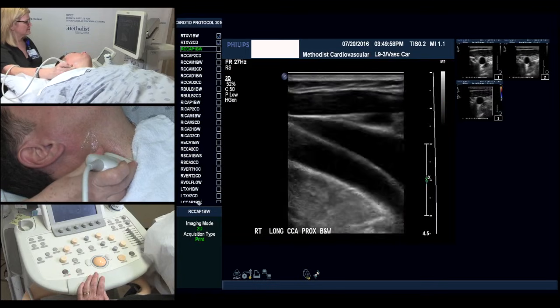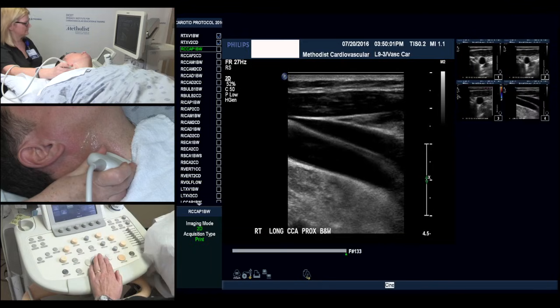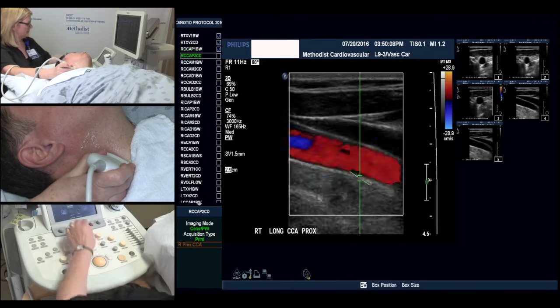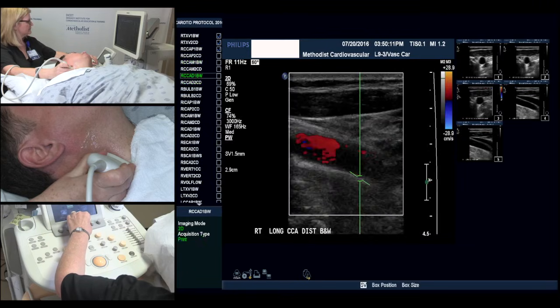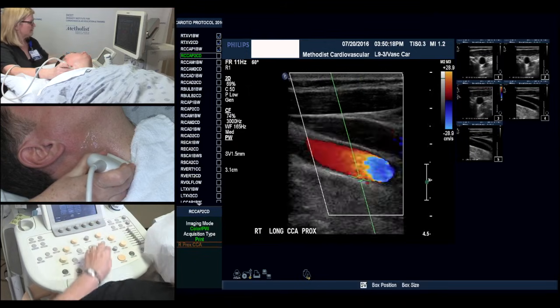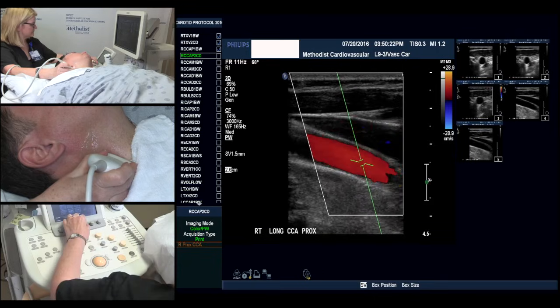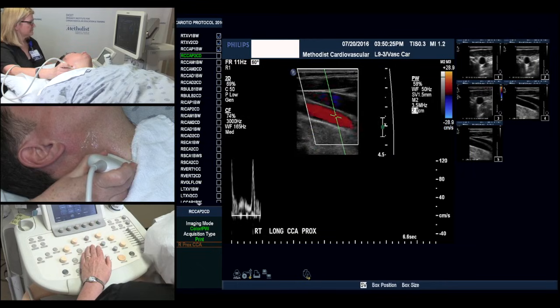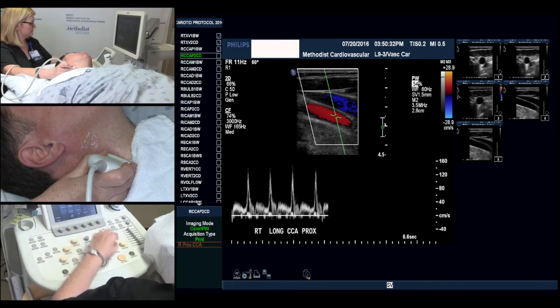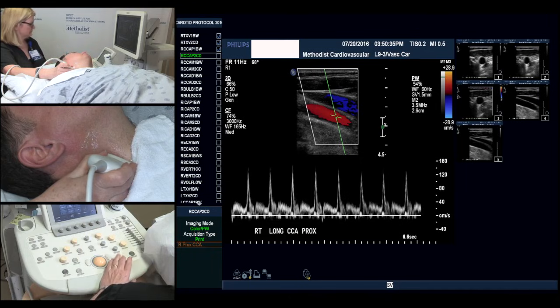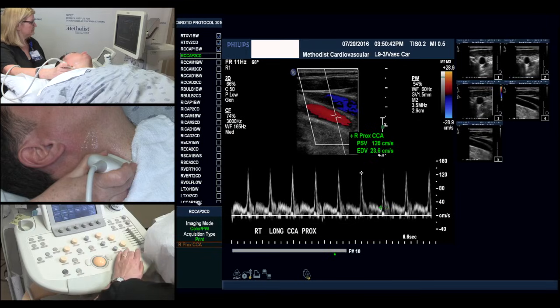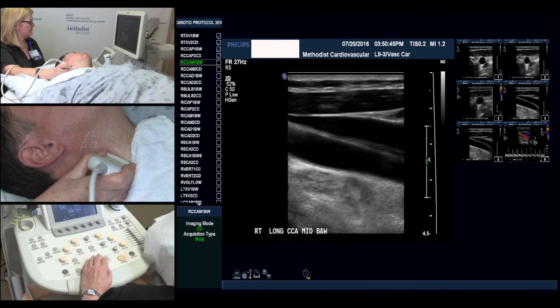We'll now go to a longitudinal approach in black and white. And now we'll go to our color. We'll measure for Doppler, steering our color box for proper angling and obtaining our Doppler signal. From here we'll measure our peak systolic velocity and end diastolic velocity, and enter it into our protocol package.